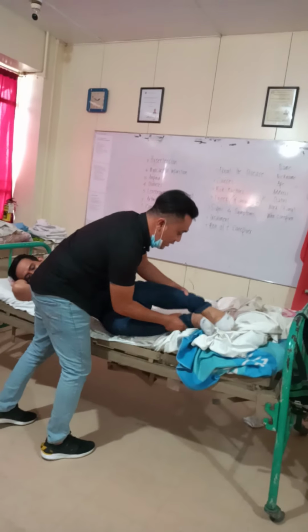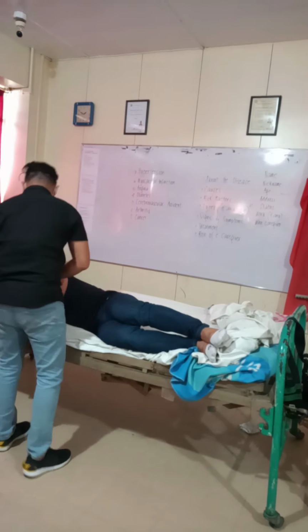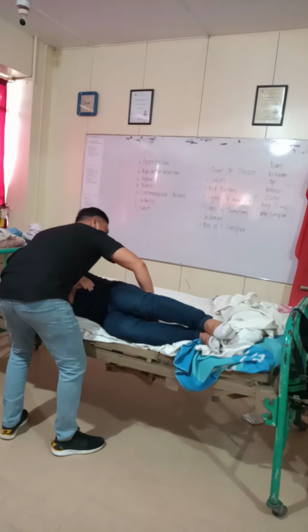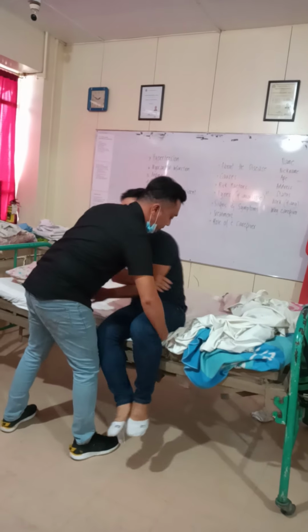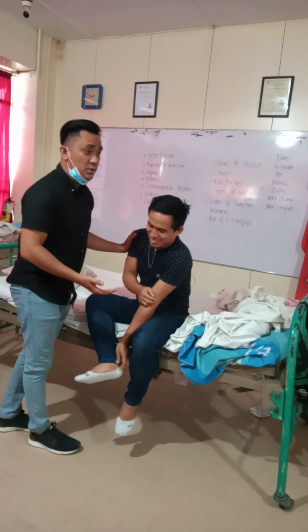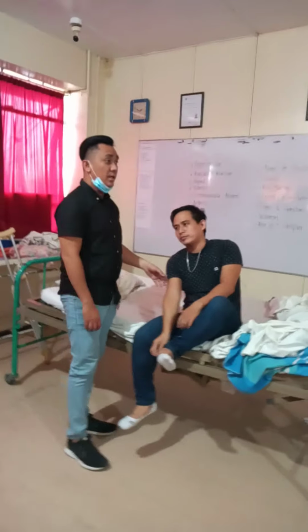If ever wala siya nakadrop, okay, maglisod mo palingkod ni patient. But if ever gani, ingunan na lang yung position, so all you have to do is gulit ka diri sa iyang shoulder and gulit ka diri sa iyang tail. Sir, at the count of 3, palingkurong tika. 1, 2, 3, likod. Gets inyo? Okay? So that's how you do sitting position. Much better na inyong i-drop ang tail ni patient daan. Okay? Para dali na kayo siya makalingkod.